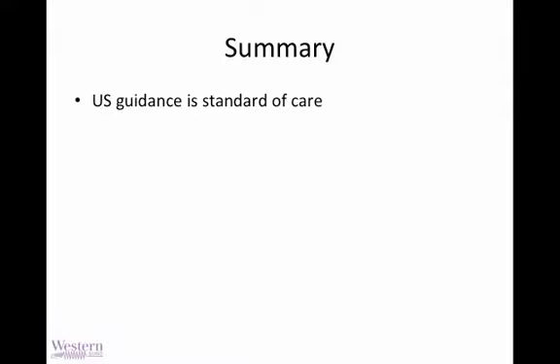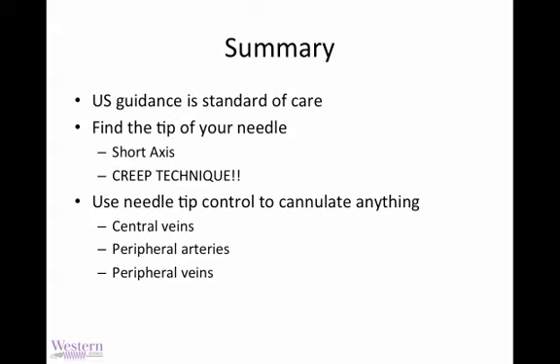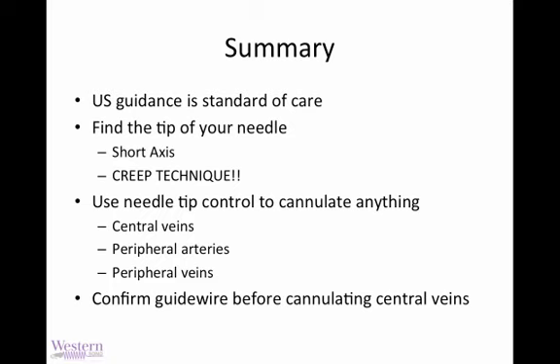So in summary, you're going to use ultrasound guidance from now on. We're sure of this. You're going to use the short axis, I hope, and the creep technique in all its glory. It's a fabulous technique. Needle tip control from that technique will allow you to cannulate veins, arteries, peripheral veins, even entertain regional anesthesia techniques, tapping of joints. The tip visualization, as long as you master that, you can become an excellent needle wielding physician or provider. And I strongly emphasize confirming your guide wire before cannulating anything, and beware of your overconfidence and the overconfidence of others.